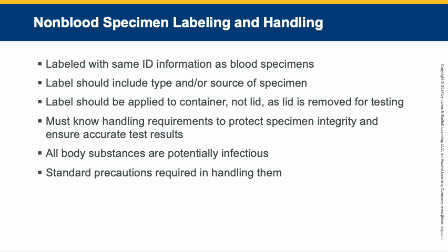If you are looking at your textbook on page 462, you will see in the key point on that page that phlebotomists are often asked to transport specimens to the lab that have already been collected by other healthcare personnel. And if you are asked to transport a specimen that you did not help collect, then you must verify that it is properly labeled before agreeing to transport it, because you need to be able to know that that is what is in that sample.